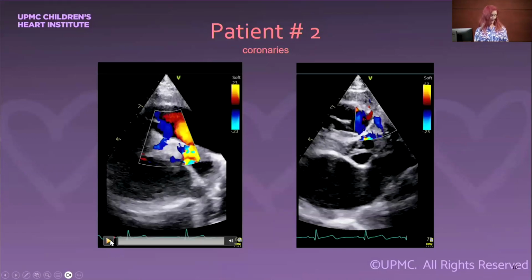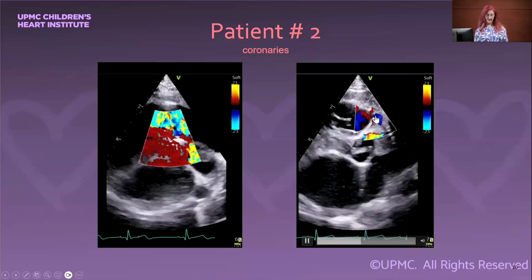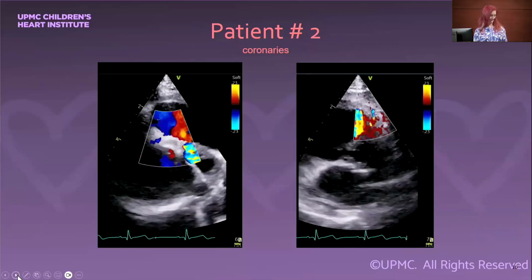This is just to show this child had normal coronaries, normal right, normal left. Speeding up.